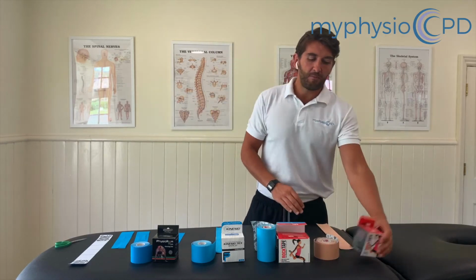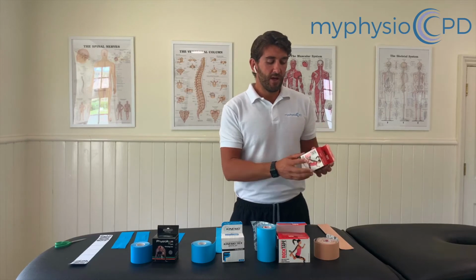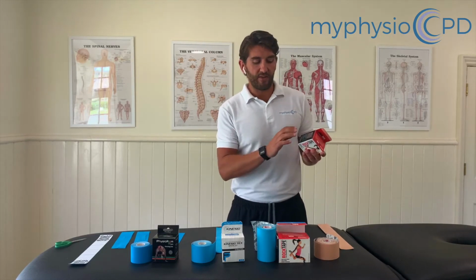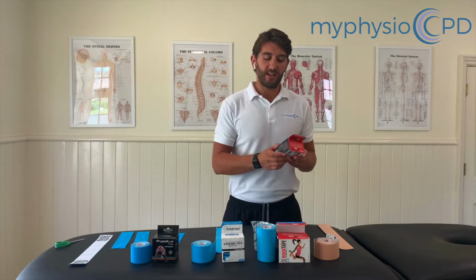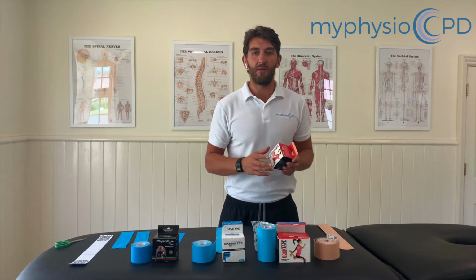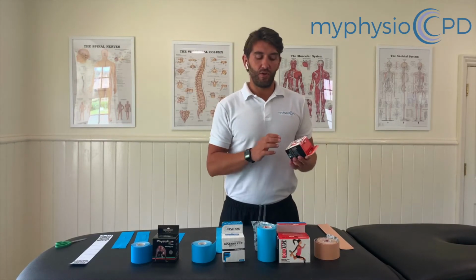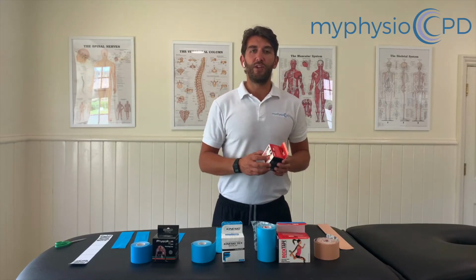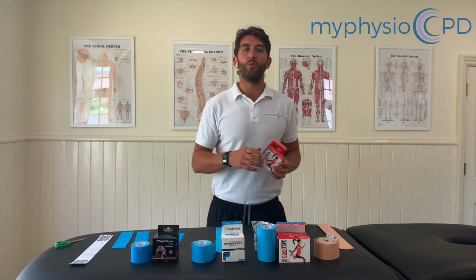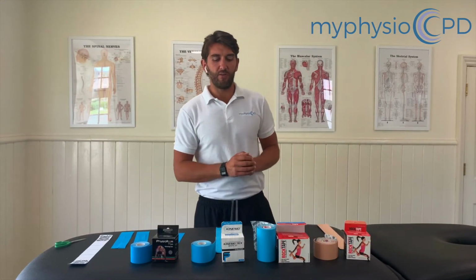So we'll start here. This is Rock Tape, very well marketed brand of tape. Their main claims are the water resistant qualities and the 180% elasticity that it gives. So it says it's more stretchy and more robust than the other tapes. Marketed largely, as the picture depicts there, to runners, triathletes, and more recently the CrossFitters. So they want to sell a strong, robust, stretchy, waterproof brand. This roll of tape costs around £10 to £12.